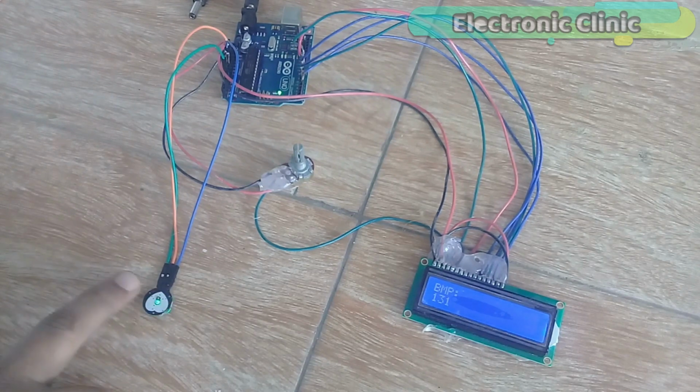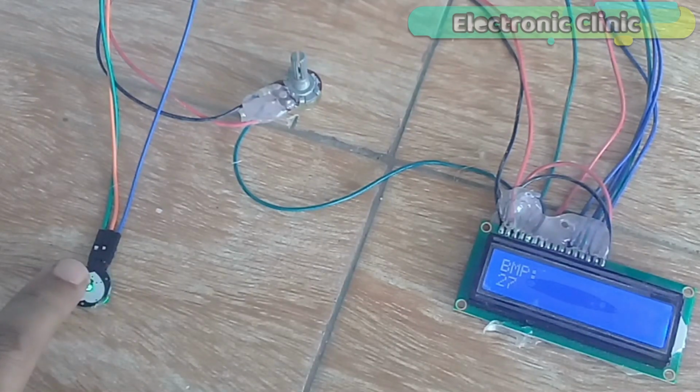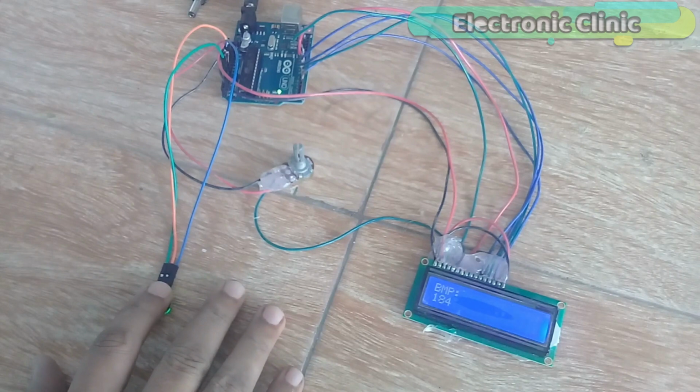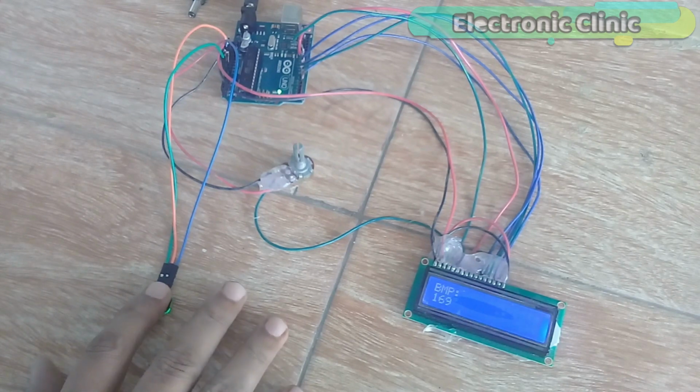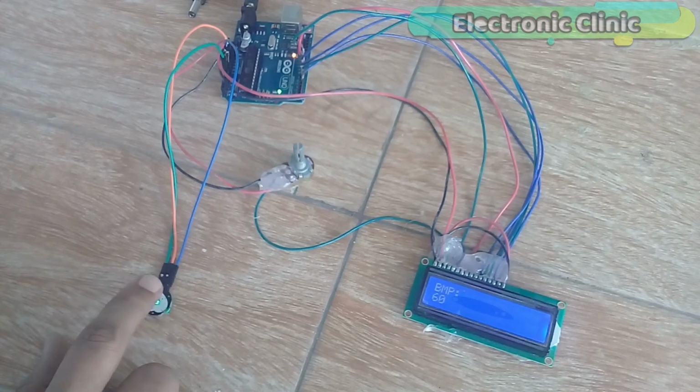As I hover my finger above the pulse sensor, you can see a change in the values. This is just because of the transmitter and receiver LED. When you tightly press the pulse sensor, then you get fluctuated values. So try not to press it hard. When you slightly press the sensor, then you get stable values. The slight fluctuation which you will see is just because I'm breathing fast and sometimes slow for the demonstration purposes to explain how the BPM values change.